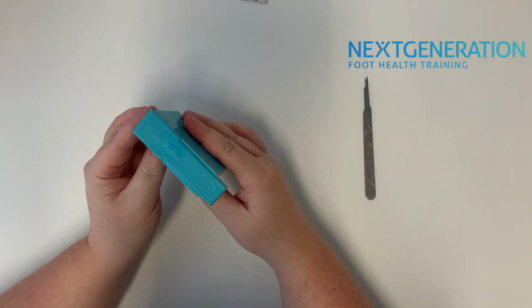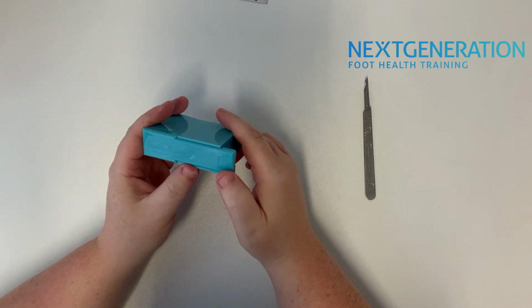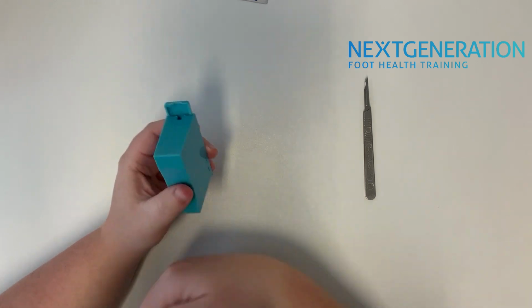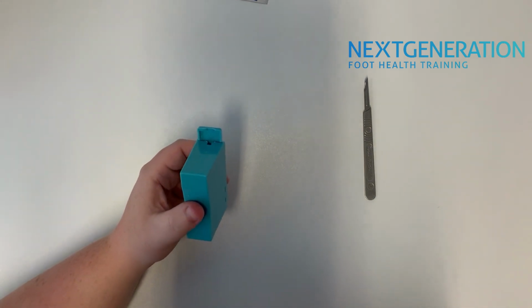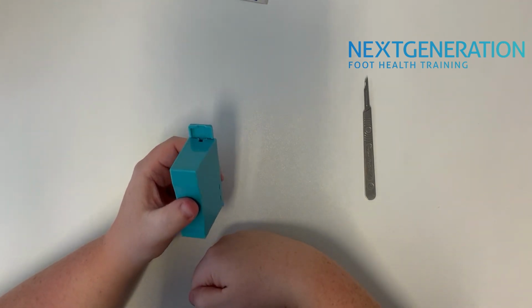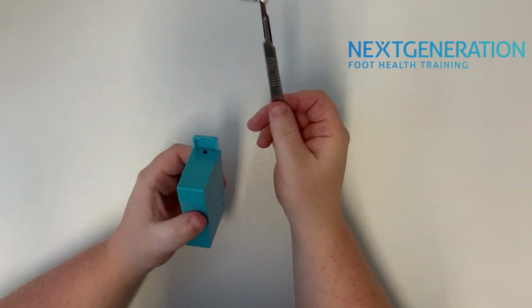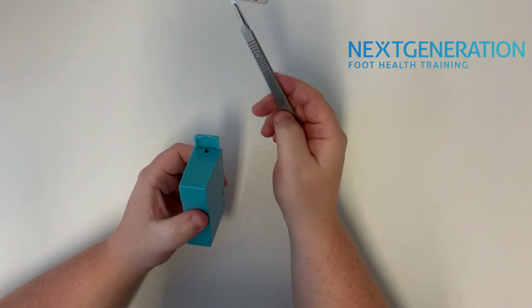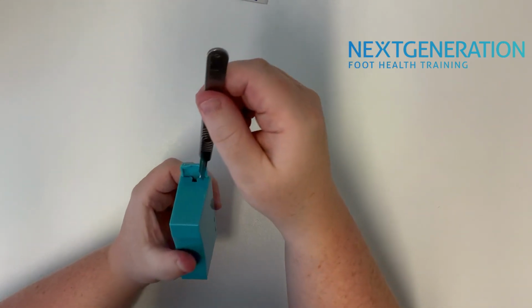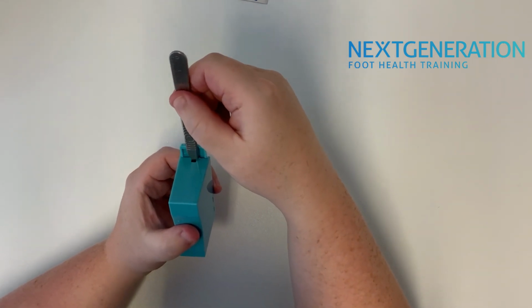So some people may do it a different way to how I'm going to teach. You'll notice it says press on the end there, if you can see that on the camera. But what I like to do is I like to actually tilt it upside down like that. So all the blades that are in here now are tilted down towards me, so there's no chance of them falling out. When we get our handle piece and our blade, we now need it with the measurement side facing up, and then we're just popping it into the hole of that box, and it'll only go so far.